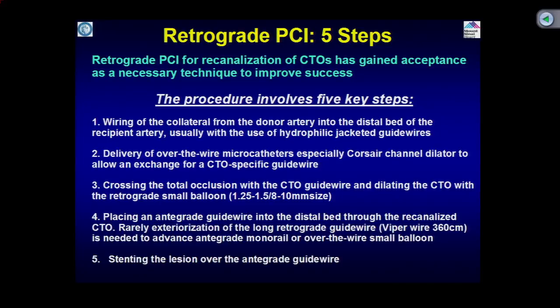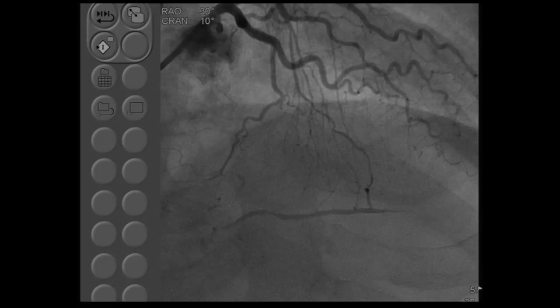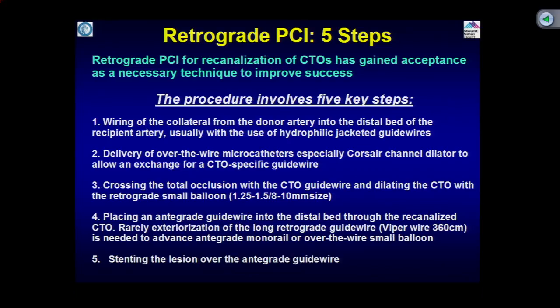Having these key points, if you can show the angiogram at this time, the main septal, you see there's one septal which has a good connection into the PDA. That's the first major septal, and that's the first branch that goes directly into the PDA, but the second branch actually then bifurcates, and we even see a connection of that septal. So we have 3 septals that we can see angiographically. So how would you start here? Although you would not be able to see.